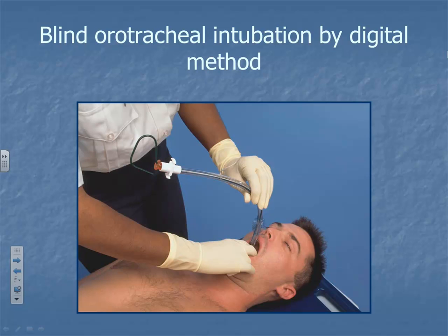So what's happening here is he's walking his right hand, he's walking his fingers down. I do my left hand. Walk the fingers down this way, and you're keeping it very tight on the tongue, and keeping it to the superior side of that. And you'll walk your fingers right down, and you'll feel the epiglottis. You can feel that with your finger. So take your long finger and grab the epiglottis and lift it up.